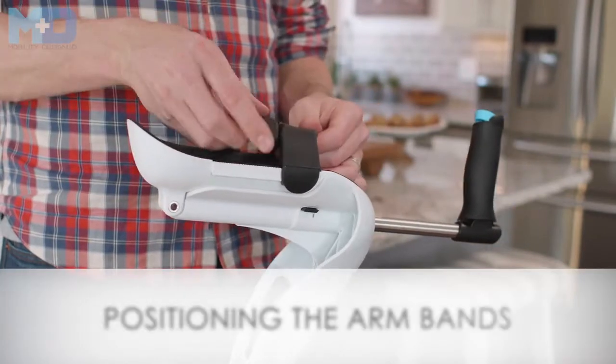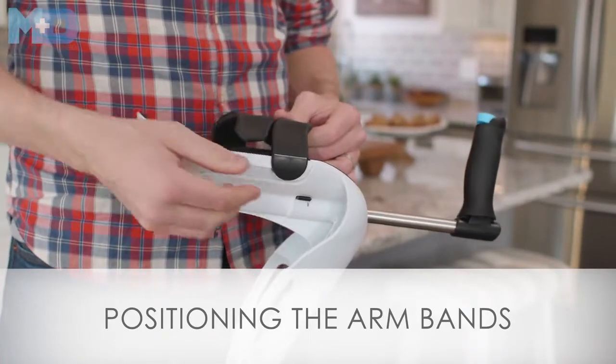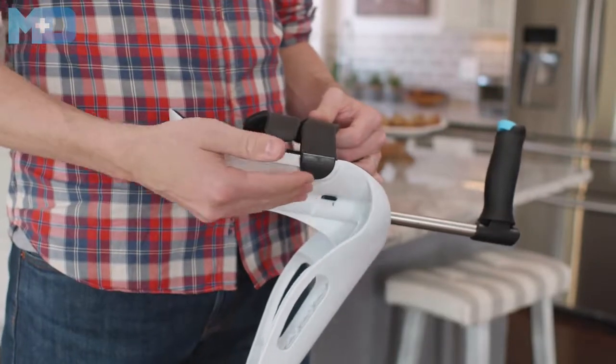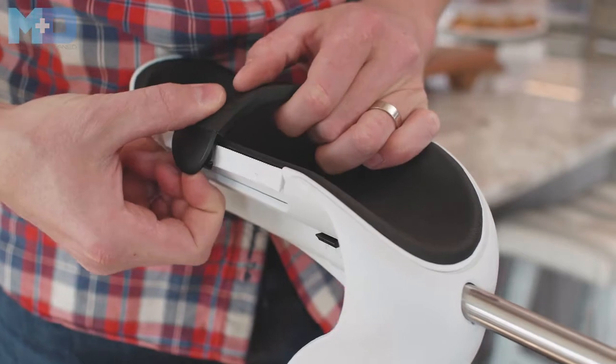The flexible arm bands allow you to get in and out of your crutch easily. They're also highly adjustable so that you can put them anywhere that fits you best. When popping your armband off, hold here and pull.